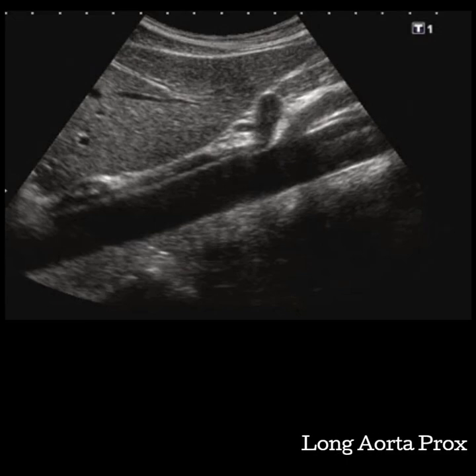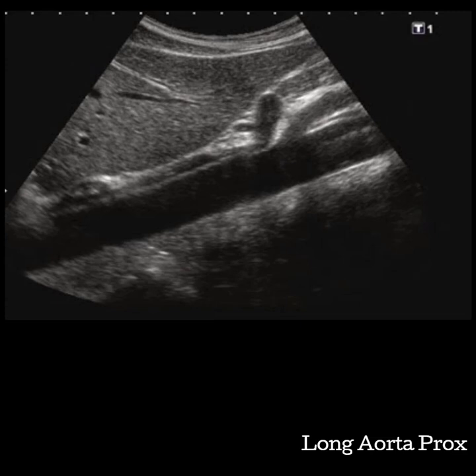The proximal aorta is quickly evaluated with one long image. This is an aorta image, so you should take care to get the aorta as horizontal as possible on the screen. This makes for better ultrasound physics, making the walls of the aorta nice and crisp. Use TGCs to clear the vessel of artifact and move the focus at or below the aorta. The proximal aorta does appear in our long left images as well, but in those images we're focusing on the liver. The reason we can focus on the liver is because we have taken this image, which focuses on the aorta.